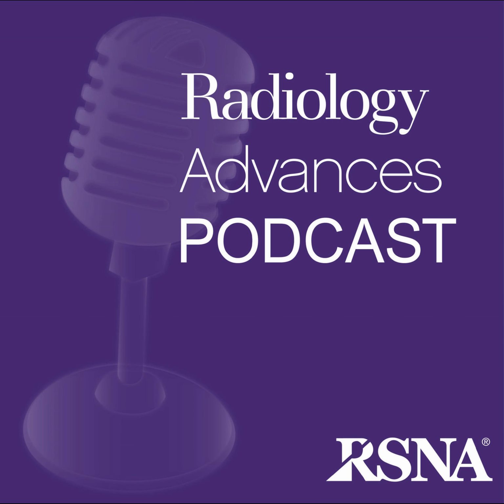As any pediatric radiologist listening knows, they do not just lie perfectly still inside a loud, claustrophobic tube. Exactly. Standard adult protocols for measuring abdominal fat usually use a breath-held Dixon MRI. You tell the adult to hold their breath, you snap the image, and you get a crisp picture with no motion artifacts. But you really cannot reliably ask an anxious 6-year-old or even a 12-year-old to hold their breath perfectly for that duration.